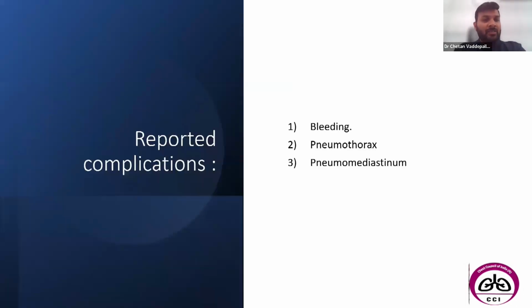The reported complications so far in the literature are minor bleeding, pneumothorax, pneumomediastinum, and none of these are fatal. So apparently it is a very safe procedure that can be done with good training.